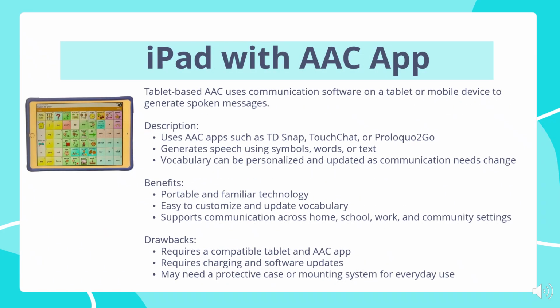Tablet or iPad-based AAC uses communication software on a tablet or mobile device to generate spoken messages. Popular AAC apps to download include TD Snap, TouchChat, and Proloquo2Go. These apps generate speech using symbols, words, or text, and vocabulary can be personalized and updated as communication needs change.